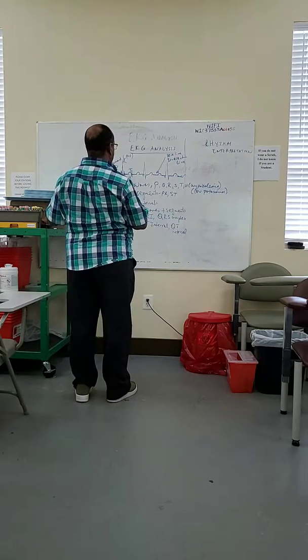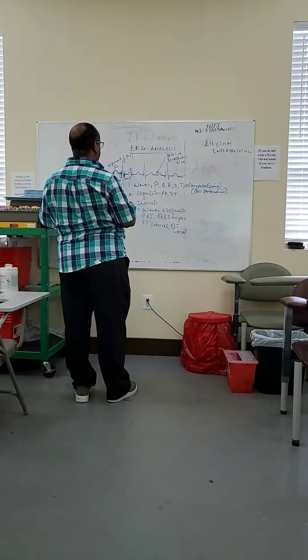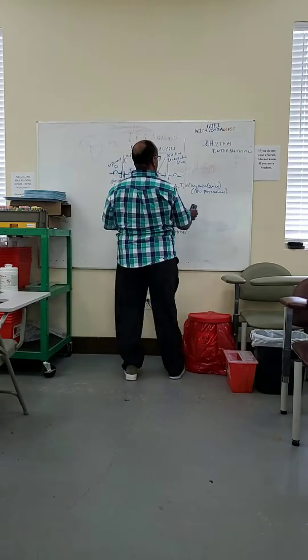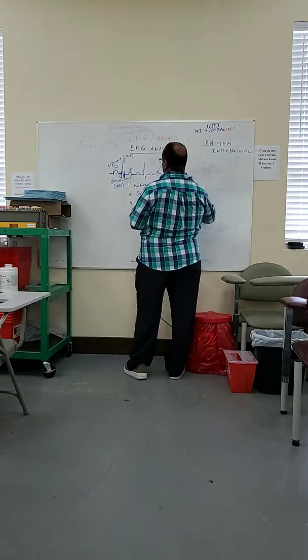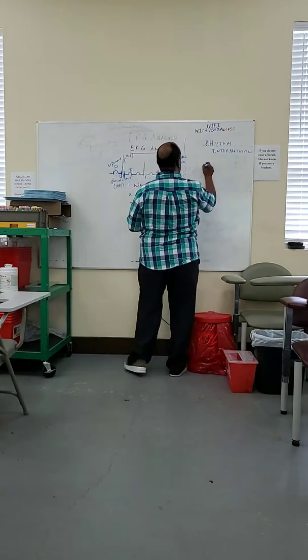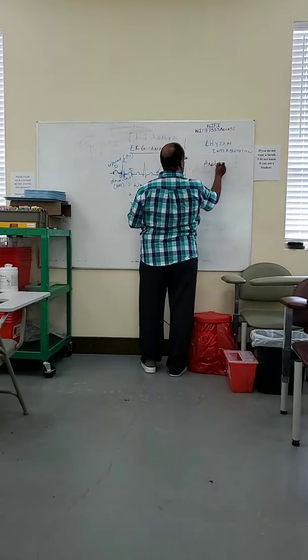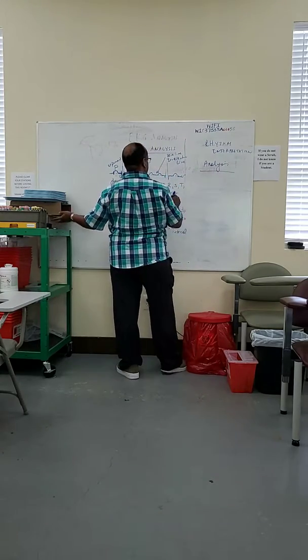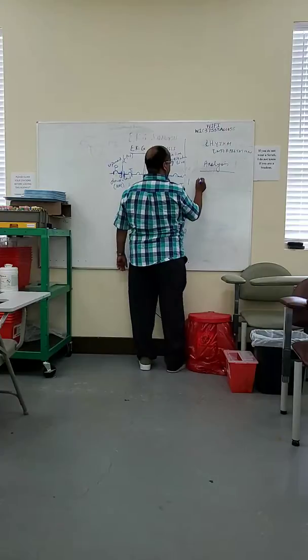Now, after we see this, which things are we going to see when we do the analysis? In analysis, we mainly do five to six things. One, the rhythm.